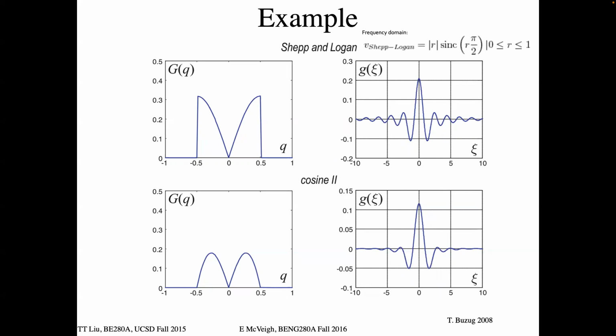They're well guarded secrets, right, for each vendor? They feel that it's very important for them to use this particular filter on their machine, and they won't tell you what it is. So you have to go to all this trouble to go and measure the damn thing. You just do phantom experiments and average it up enough so that you look and see what the point spread function is. I don't know why they won't do it, but anyway, I think early on there was some leap in technology that someone made that way, and so historically they just don't let these things out the door.